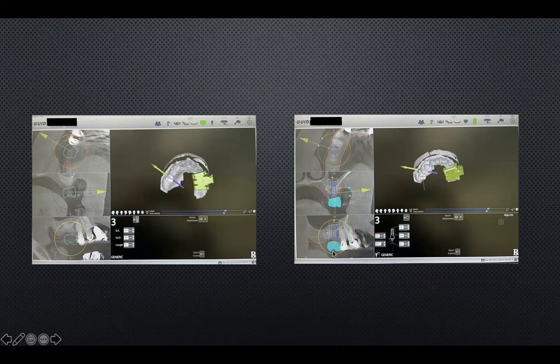We design it to have an access screw hole through the central fossa of number 3, or of the virtual crown. And we have to have at least 3 millimeter of clearance between it and the adjacent tooth, 1.5 millimeter clearance from the adjacent tooth. And in this case, we are planning to do a simultaneous sinus graft procedure, and it's going to be through the crest.